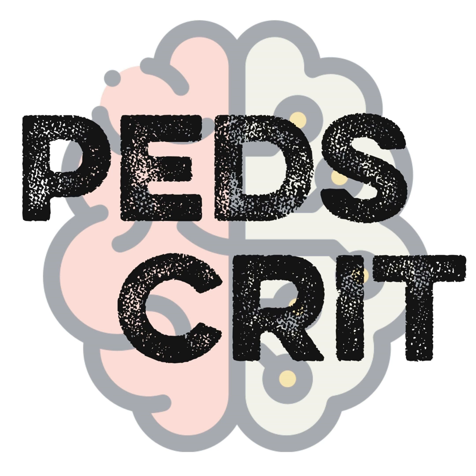The P low is generally set at 0, and you are going to maintain lung recruitment during those releases via the generation of auto PEEP. So in that fixed setting, you maintain your lung recruitment with your set P low. In this way of doing it, you're going to maintain your lung volume at exhalation with an auto PEEP.